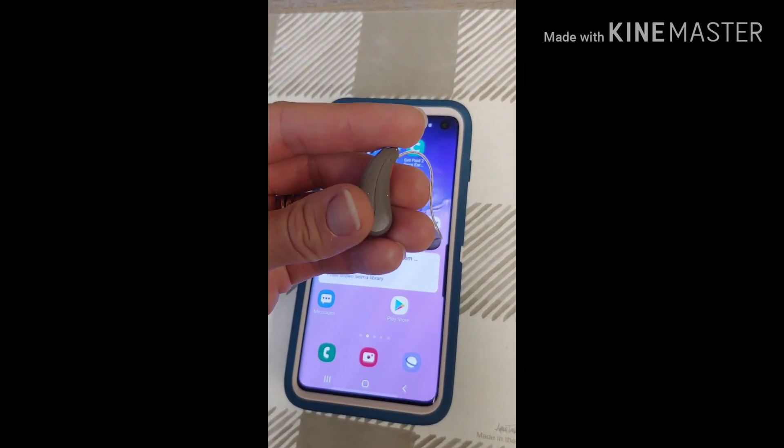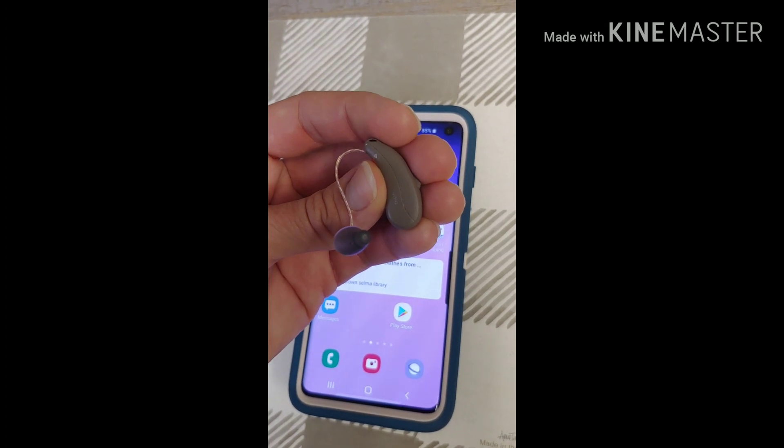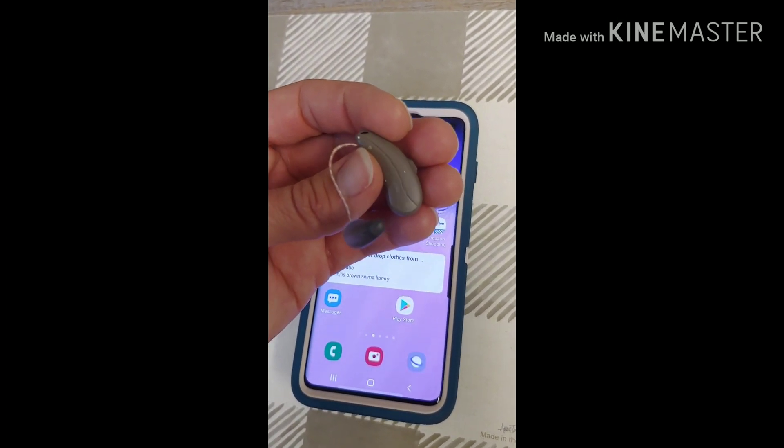Dr. Coates here. I'm going to show you today how to connect your Signia PureCharge & Go NX hearing aid to the Touch Control app for your smartphone.